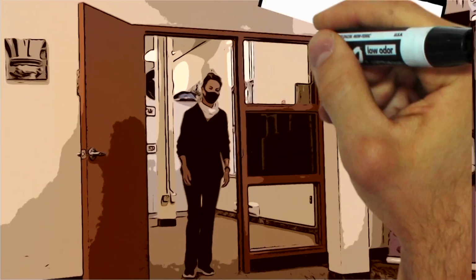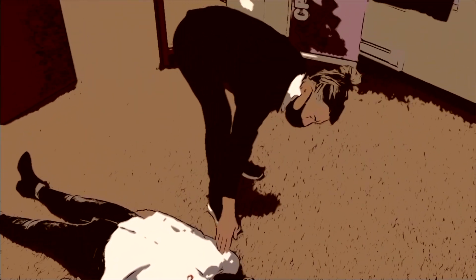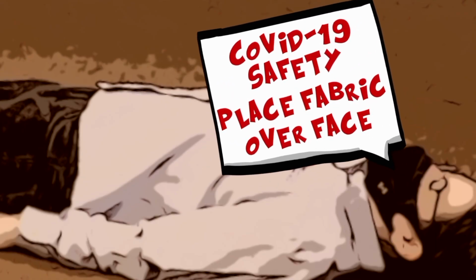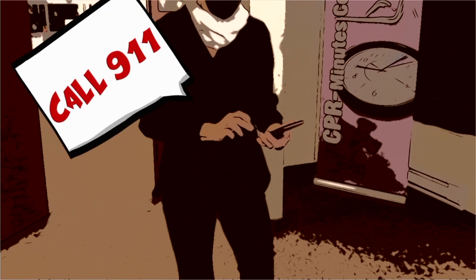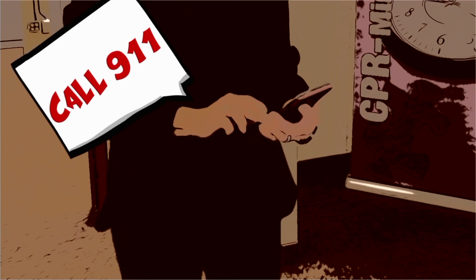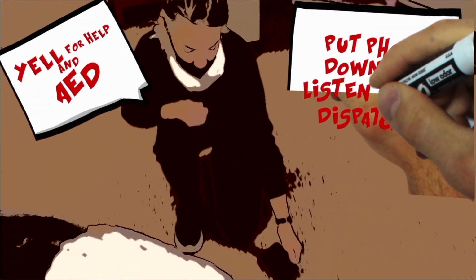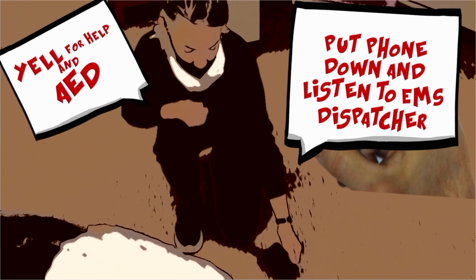Tap and shout. With concerns over COVID-19, place fabric over face. Call 911 immediately. Yell for help and an AED. Put your phone down and listen to the EMS dispatcher.